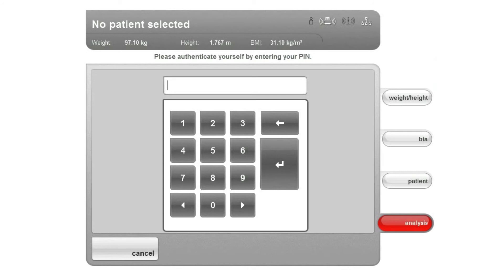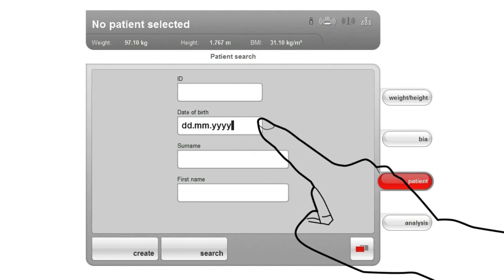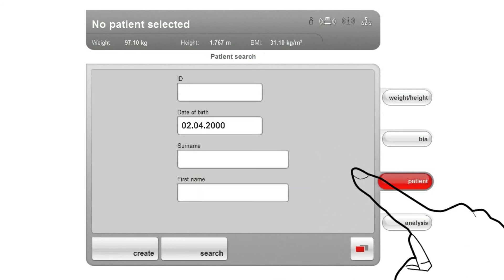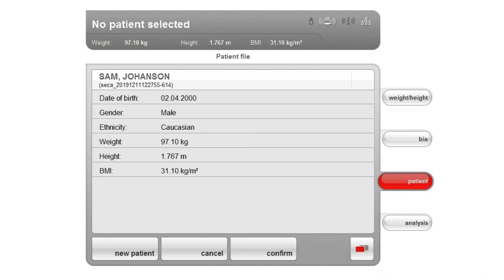A login window appears. The user logs in with his or her user password. If a file for your subject already exists on the MBCA or in the Seka PC software, enter the date of birth. Confirm that you wish to open this file, and then the file opens.